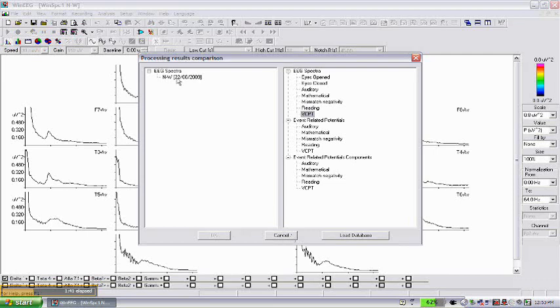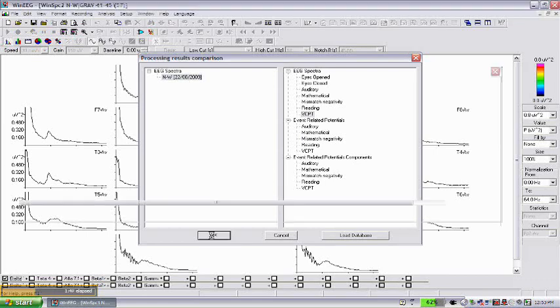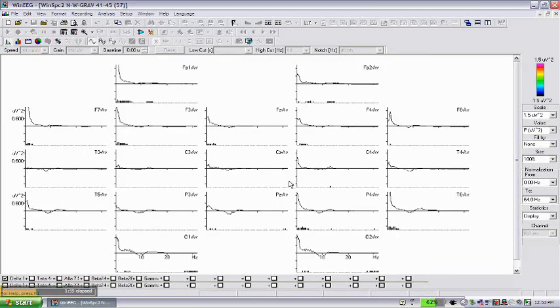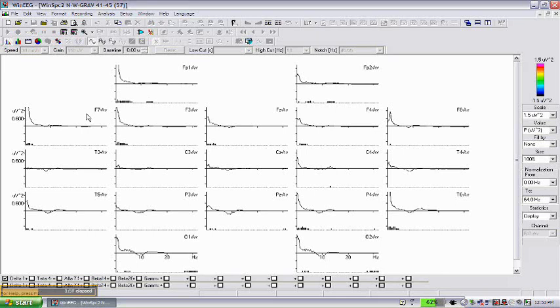We select patient, we click OK, and we got the difference wave. Each graph is the difference between the patient spectra and the normal spectra. We compute spectra for the group of healthy subjects of the corresponding age and we subtract the spectra from the spectra of this patient.